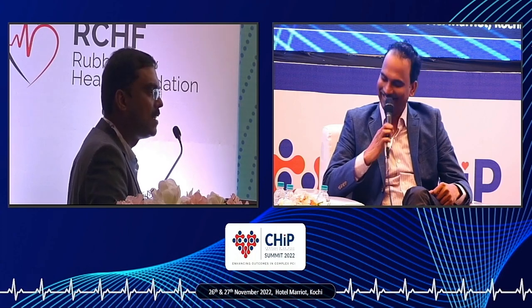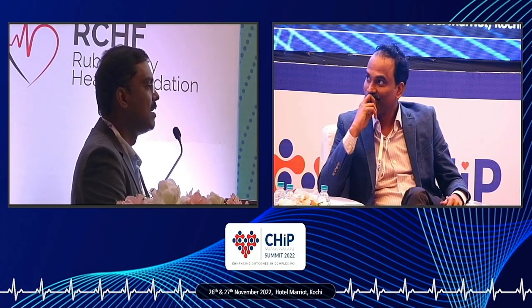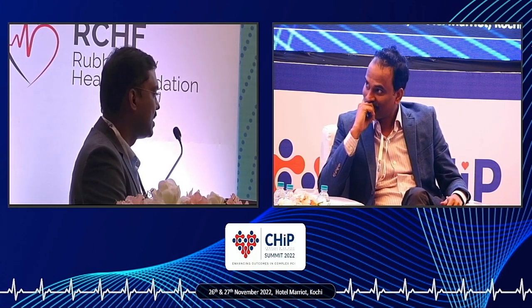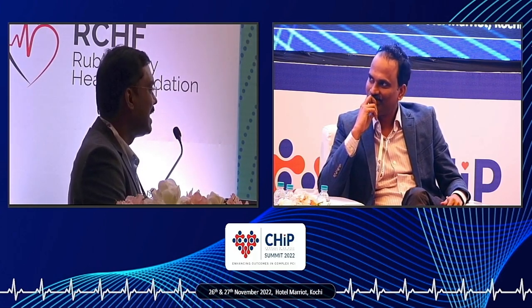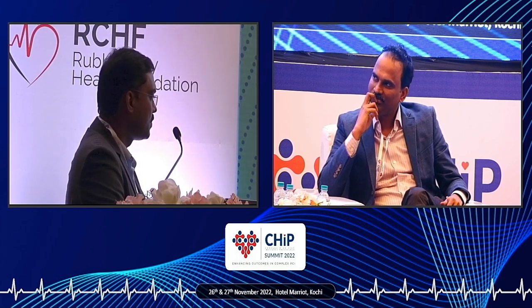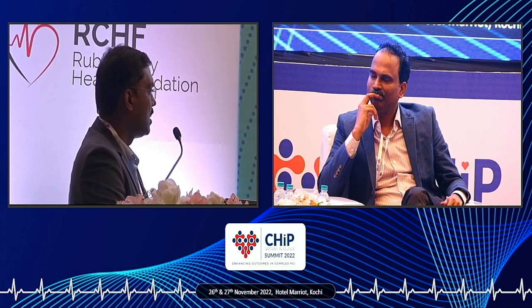Yeah, nice thought. In fact, my approach to LMCA PCI is more than 80-90% provisional only. I still follow the Korean rather than the Chinese philosophy. Unless the patient goes in for a complication like bailout, usually the approach is provisional, whatever the DK CRUSH data says is superior. Still, I feel the provisional approach is better. In some cases where I feel some dilatation should be done in a provisional, I usually do a DCB the first time itself, final kissing balloon with a DCB.